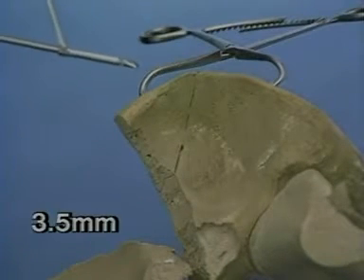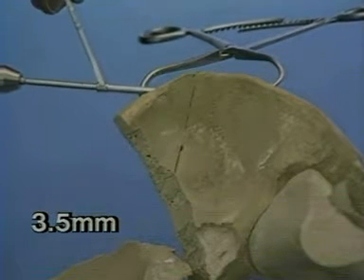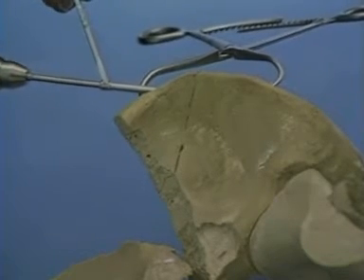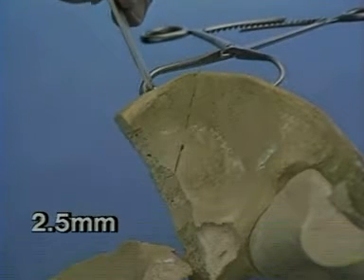Fixation is performed with a 3.5 millimeter lag screw placed between the two tables of the ilium parallel to the iliac crest. A 3.5 millimeter drill bit drills the proximal gliding hole. A 2.5 millimeter drill is used for the threaded hole in the intact ilium.